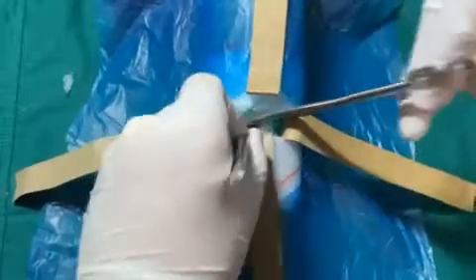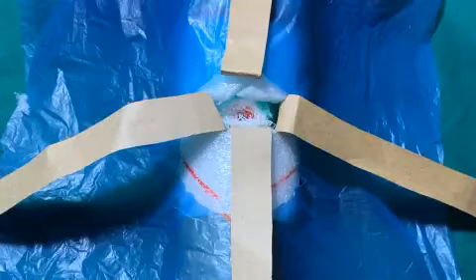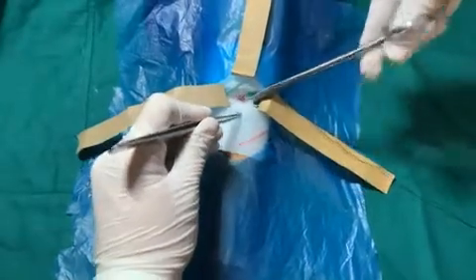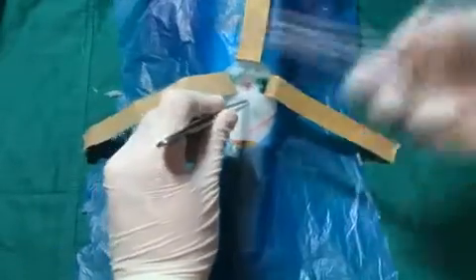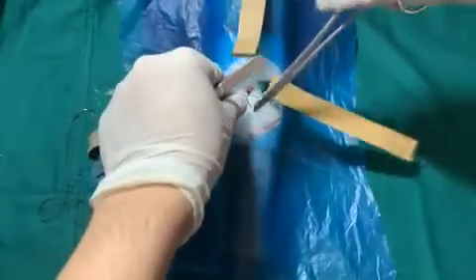Create an inferiorly placed flap raised from the anterior wall of the third and fourth tracheal rings. This is the safest tracheostomy in adults. After the flap is created, a silk traction suture is passed through this anterior tracheal flap and is loosely secured to the skin.